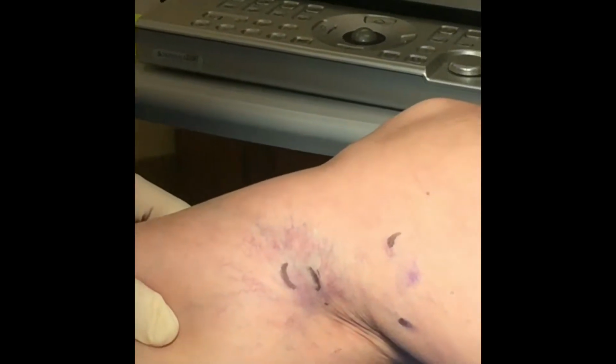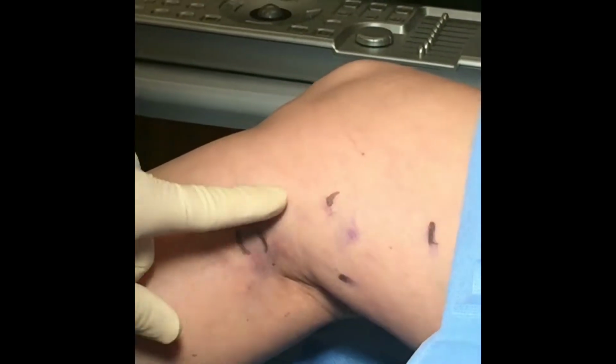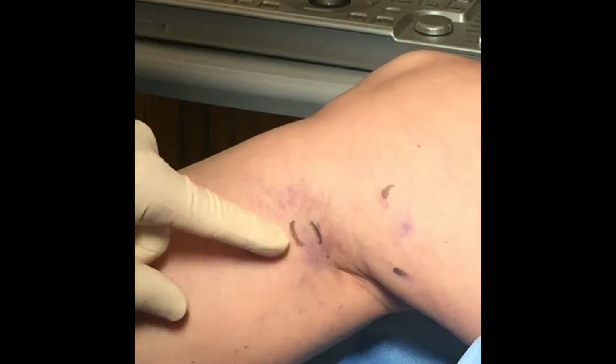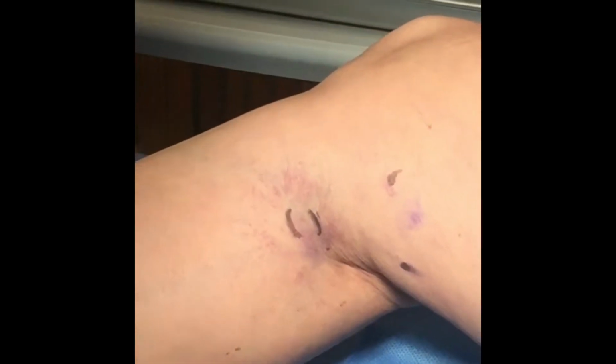We actually showed on ultrasound today that there is a vein in her thigh which has backwards flow, which is pressurizing this patch of spider vein. So it's very important to treat that vein first. And the way we do it is with something called Ultrasound Guided Foam Sclerotherapy.